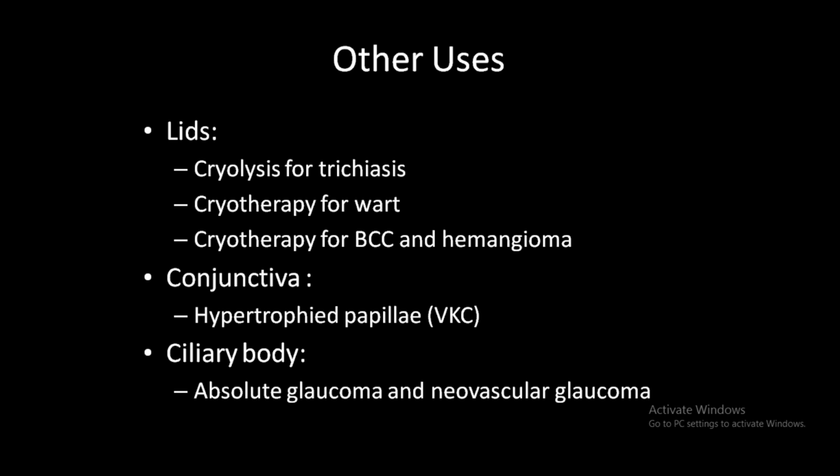So basically, cryo is usually a last resort in cases of glaucoma, where it is absolute glaucoma or neovascular glaucoma, where there is no vision salvageable and you want to decrease the intraocular pressure. You can go for cryotherapy. And if hypertrophied papillae are present in cases of VKC, there also cryotherapy can be applied. And in cases of lid lesions like basal cell carcinoma, warts or trichiasis, cryotherapy can be applied.